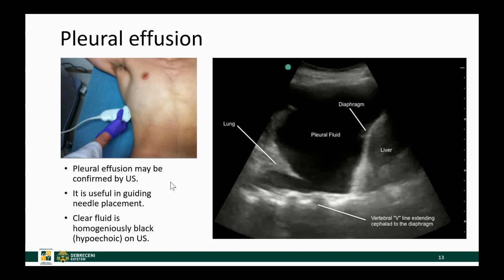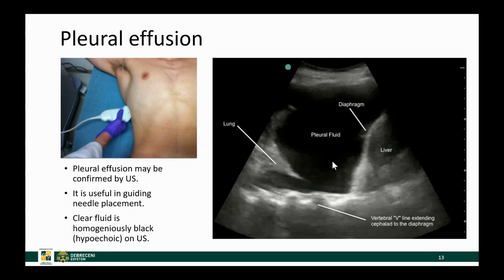If there is pleural effusion, you can always perform an ultrasound. If you position the convex transducer at this location, you will get an image where you will see the liver, the echogenic line of the diaphragm, and the anechoic fluid below the lung. This would be the lung, and this is the subpulmonary region behind the lung, close to the vertebral bodies, and in front of the lung. With ultrasound, you can differentiate a homogeneously black fluid versus a more echogenic fluid, which might be pus or blood, and of course you can guide needle placement as well.